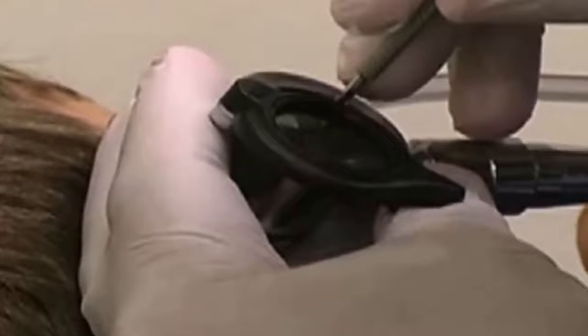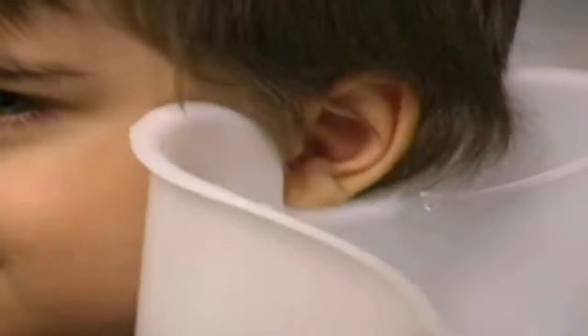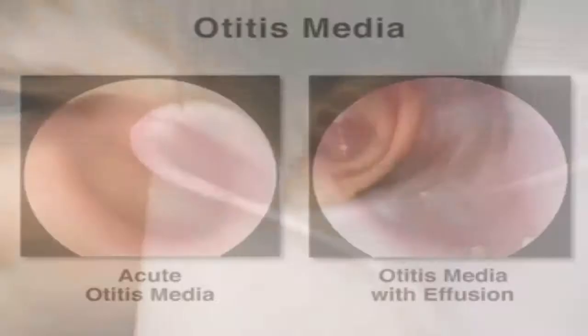Pneumatic otoscopy and cerumen removal will be discussed in this video. Mastery of otoscopic examination techniques is necessary for the accurate diagnosis of otitis media.